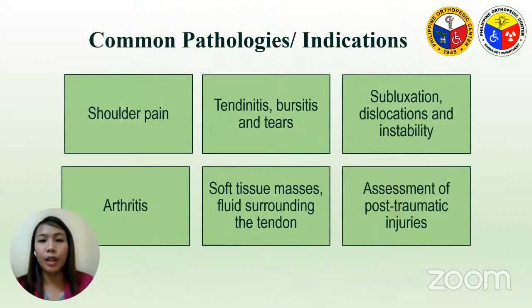Shoulder ultrasound can be utilized to evaluate and diagnose shoulder problems in a variety of clinical settings. These are the most prevalent pathologies diagnosed by ultrasound. Common indications for performing an ultrasound on the shoulder include shoulder pain, which may be caused by, among other things, rotator cuff injuries, tendinitis, bursitis, impingement syndrome, or arthritis, all of which can be diagnosed with an ultrasound. Utilizing ultrasound technology rather than radiation, ultrasound of the shoulder can be highly effective in diagnosing diseases.